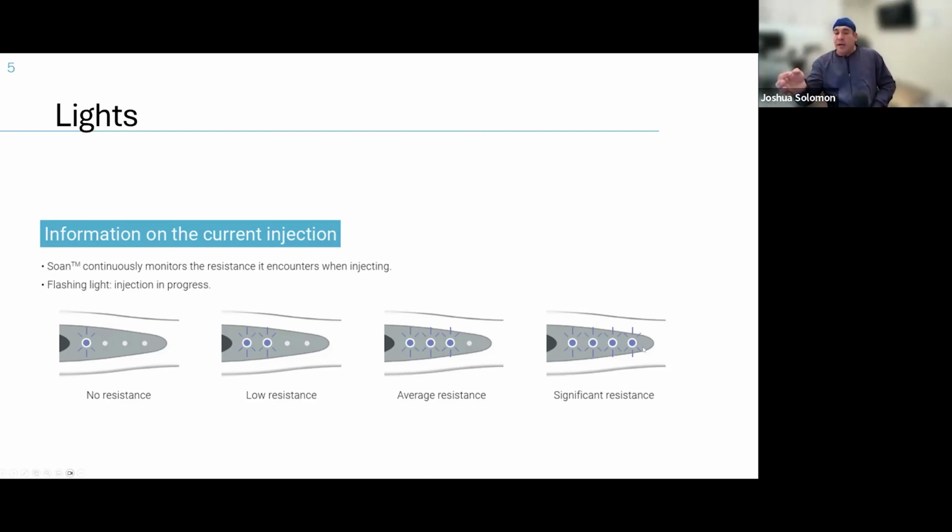Two things. Number 1, I'll just back out slightly, and then I'll continue giving my injection. The reason I don't want to come off my pedal right away is, remember, there is that ramp up, right? If you come off your pedal and step on it again, you're going to have to start that ramp up speed. So I will just back out a little bit, or slightly rotate. You need to remember that your unit will always keep you safe. If the unit feels like there's too much resistance, too much back pressure, it'll actually back out your plunger. So you get to 4, back out just a little bit.